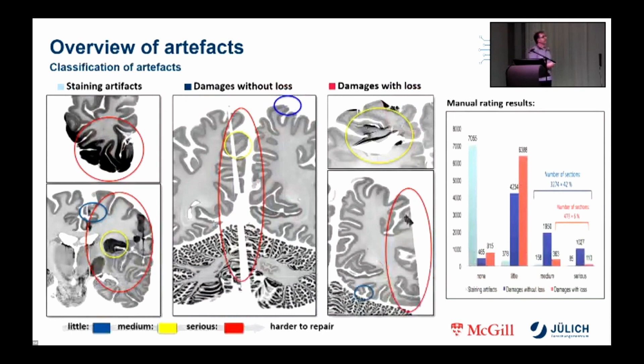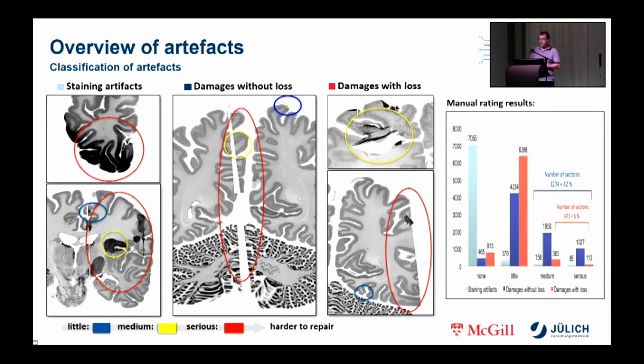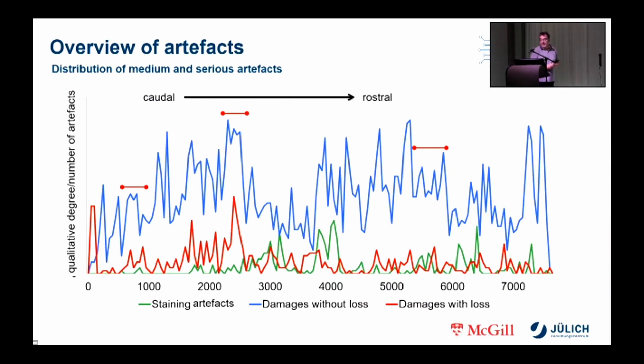In order to record the artifacts both quantitatively and qualitatively, we have divided them into three groups: staining artifacts, damage without loss, and damage with loss. Within these groups we also distinguish between minor, medium and serious artifacts. The result of a manual classification, depicted in the diagram on the right side, showed that about 42 percent of all sections had medium to even severe artifacts. Furthermore, artifacts often extend over several consecutive sections, which is of great importance for the repairs — this fact hampers any repair method based on consecutive sections only.